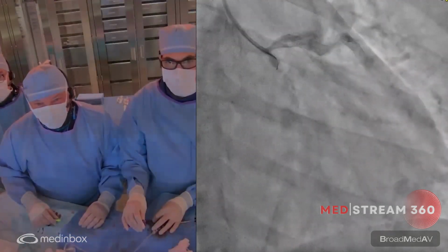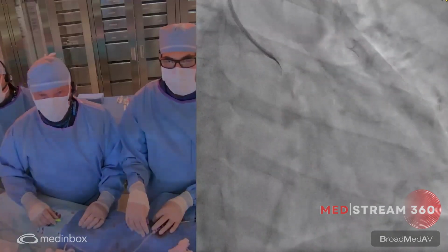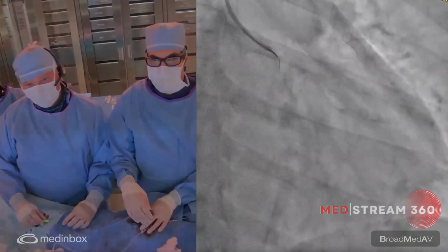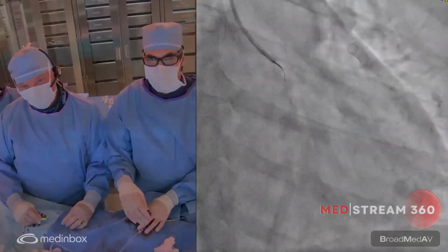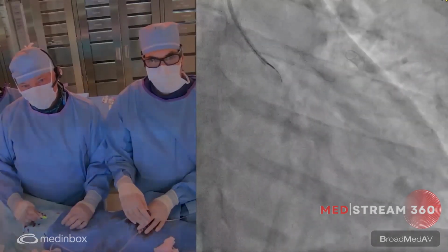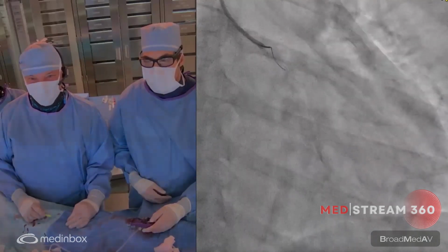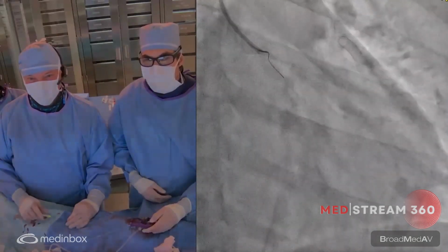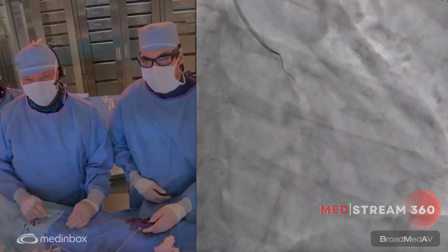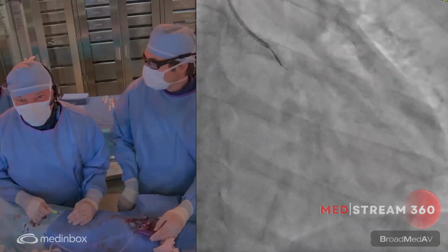So I look with the test if I change anything. You see, it's already more direct to the lesion. Yeah, he went through the aneurysm easily. Yeah, good control. Yeah, that looks close. And there's another aneurysm. Yeah. That's a small branch.